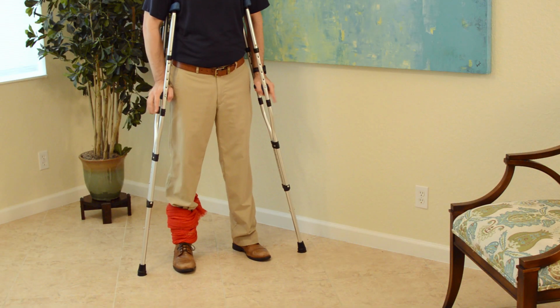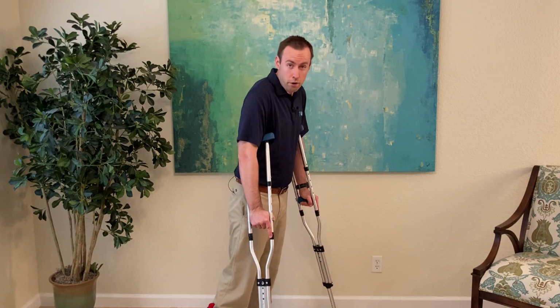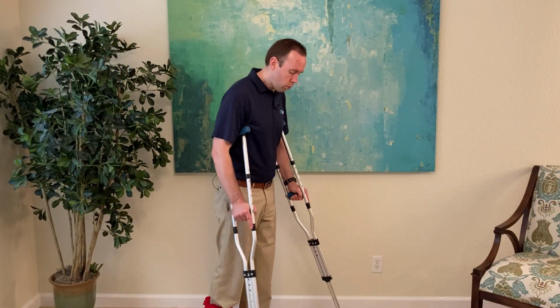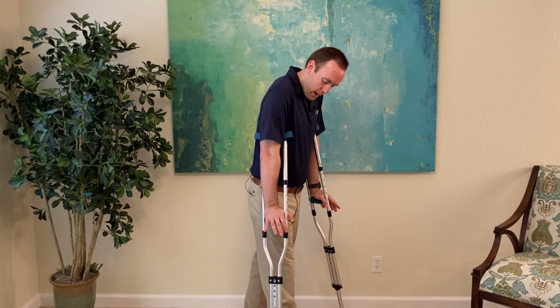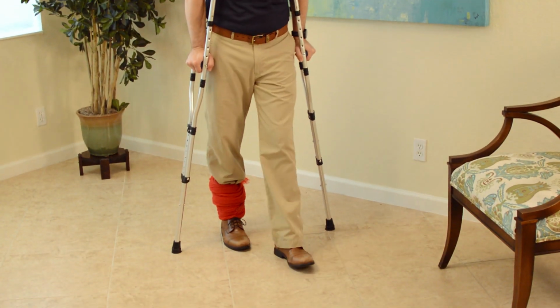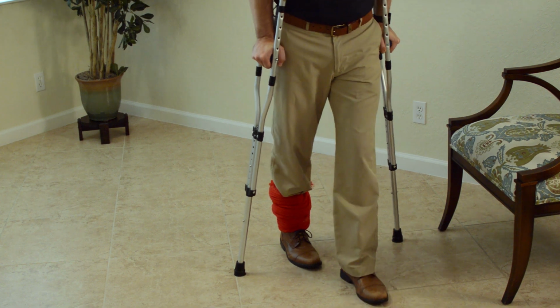Your feet are standing in between the 2 posts. What you're going to do first is put the crutches out in front of you, and then the right foot, or the hurt foot, is going to step right between the 2 crutches, okay? So it goes crutches, right foot, and then that's when you can bear the weight through your hands. I'm not cramming them up into my armpits. I'm squeezing them against my side, and I'm bearing the weight down here. And then I'm bringing my left leg, or the good leg, through, okay? So it goes crutches, hurt leg between the posts, bring the other leg through.